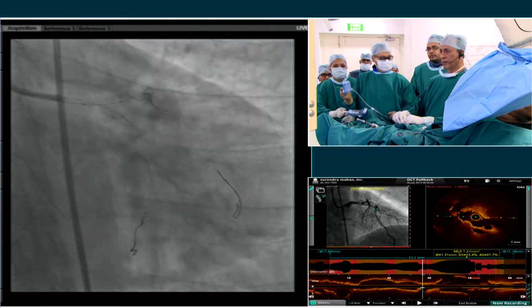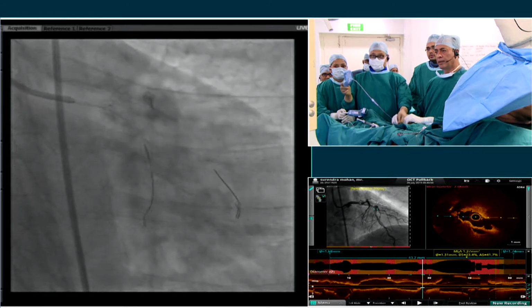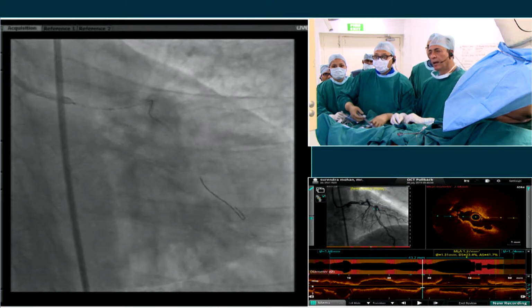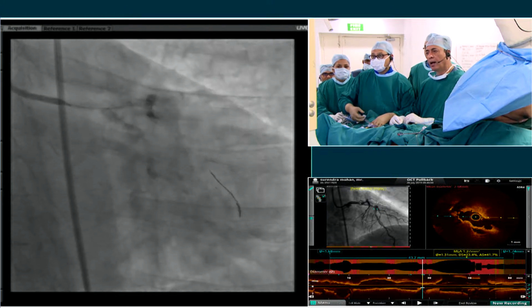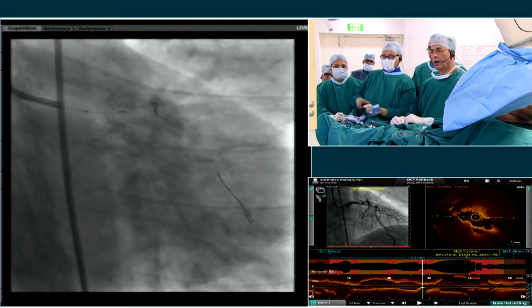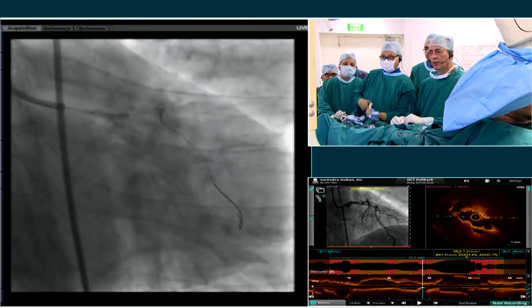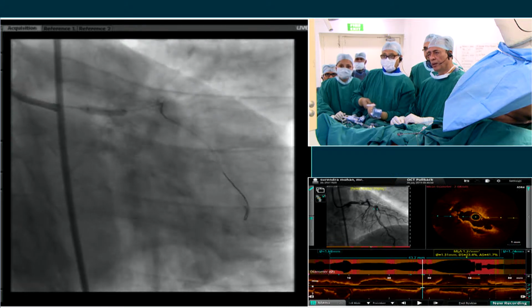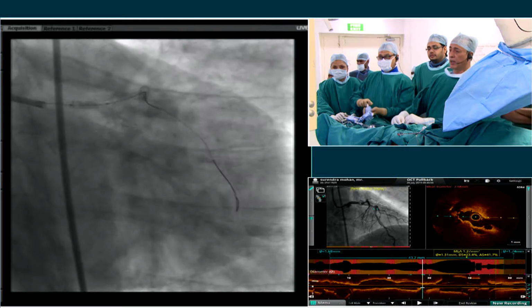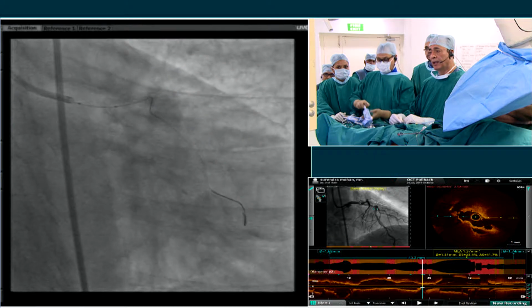No, cross it. Take out the wire. We have to take out the wire, and then we'll cross it. Just 1 minute. Oh, okay, cross it now. Go more. Okay, it's a 3 millimeter, 3.5, 12. And we cross the first cross here, and we'll see the result.